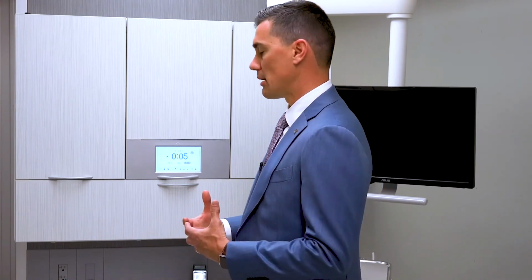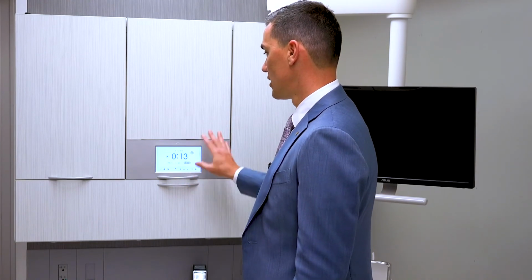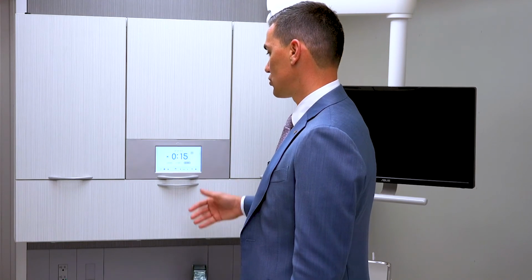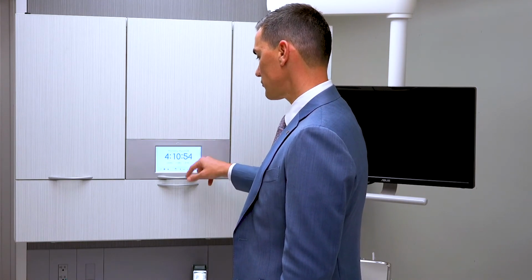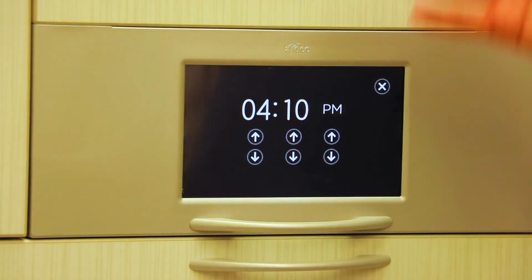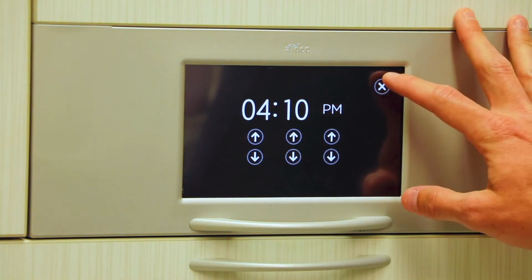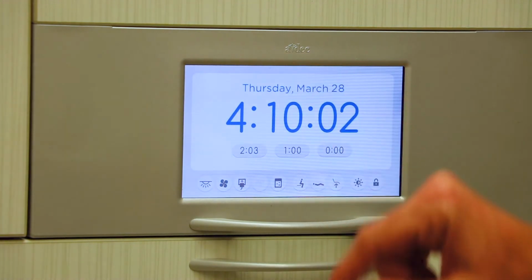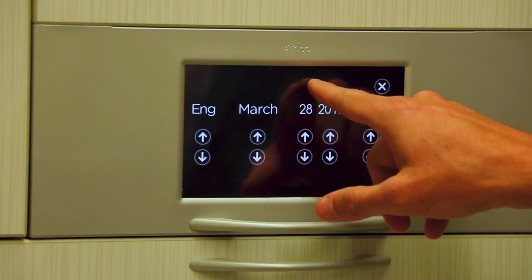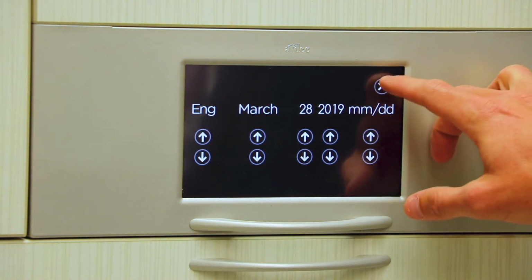So if you want to see how long a procedure takes you to do or see how long it takes to turn a room over or anything like that, you could walk in here, hit that button, and then see how long it takes you to actually do a procedure or turn that room over. If you need to change the time, you can actually hold the time down. You'll notice that it goes to a black screen where we can increase or change the time if needed. And then the last thing we have is the date. If we need to adjust the date, we can adjust the date to whatever we would like.